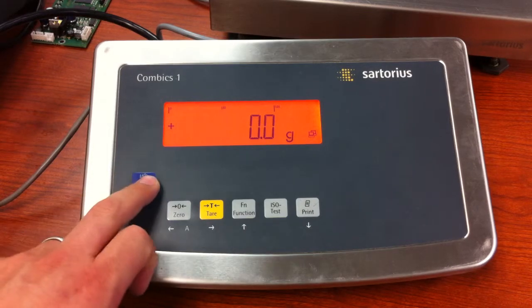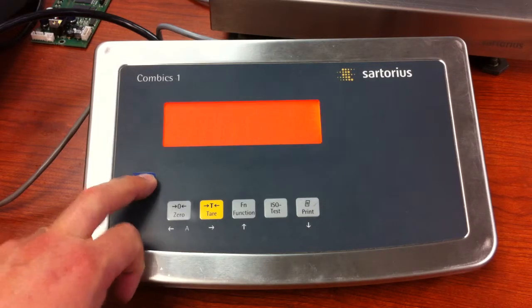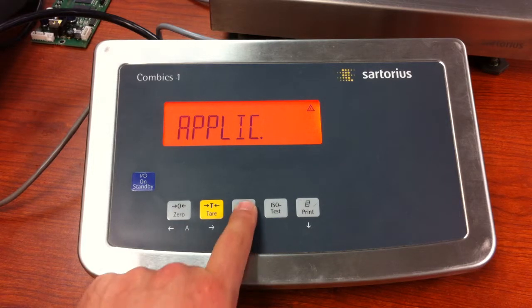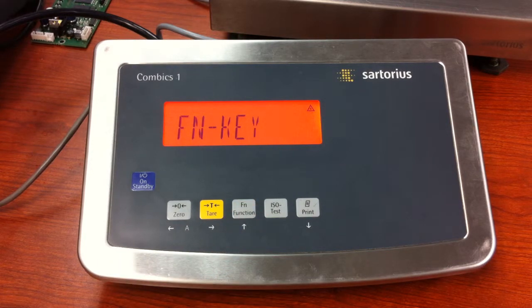First thing we do is turn the unit off, and then turn it on, press and release the tear key during the segment check. Now press and release the function key until you see FN dash key.